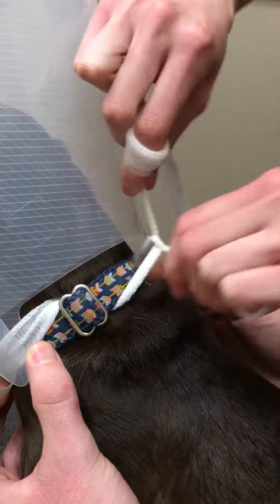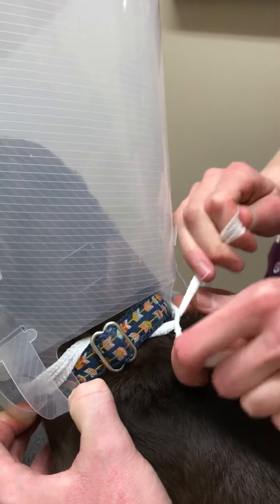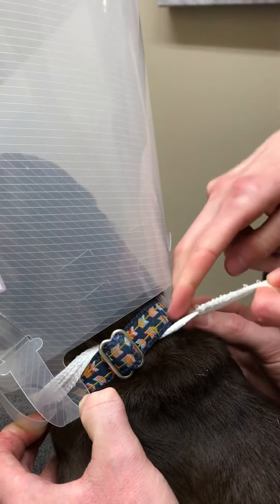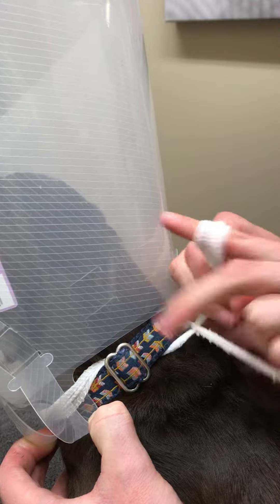We want to make sure that this isn't too tight. You're going to give it a little bit of a pull, but we always want to make sure that we can fit at least two fingers under that at all times, just to make sure that it's not too tight for them.